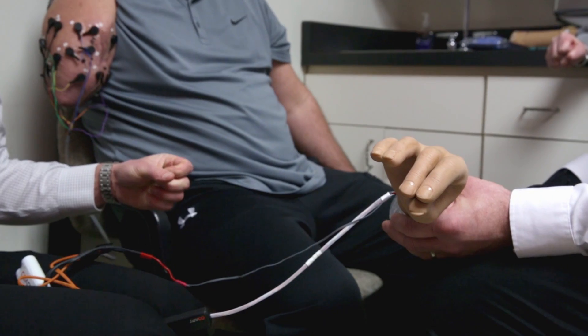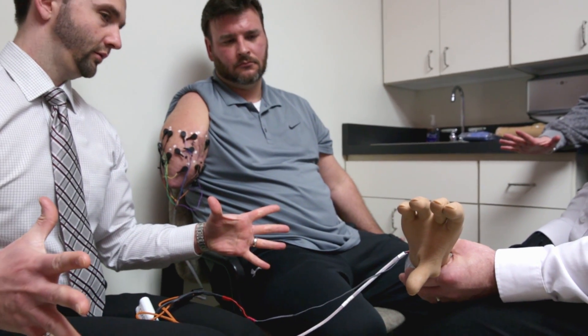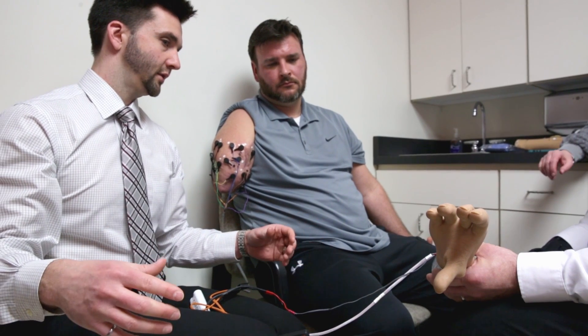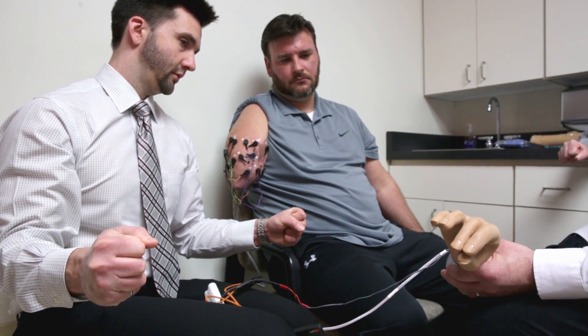This technology is like listening to a radio. The conventional style is like listening to a radio and only hearing how loud the song is. What this will help us do is listen to that music coming from your muscles — all the muscles in here — and tell what song you're trying to play.